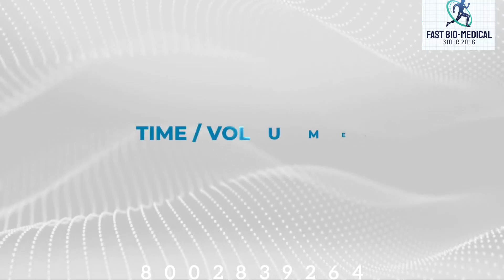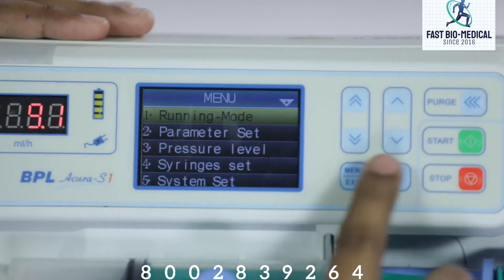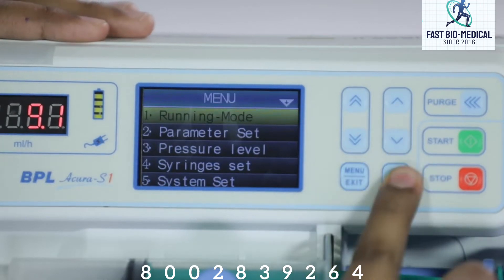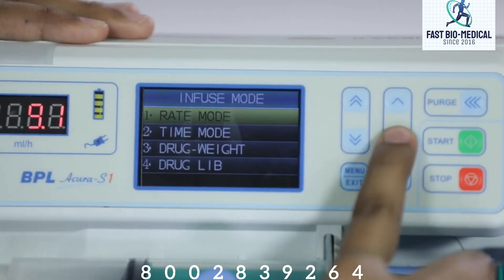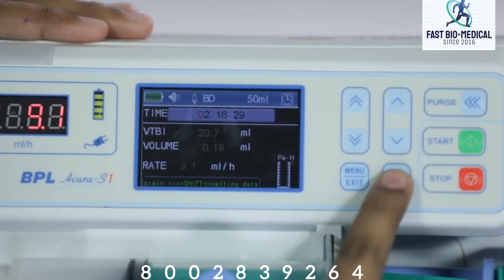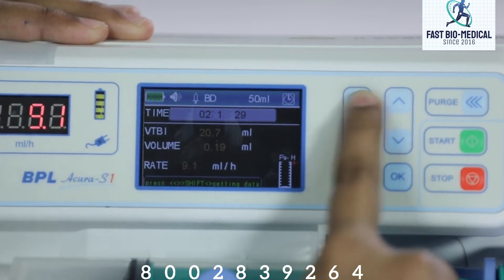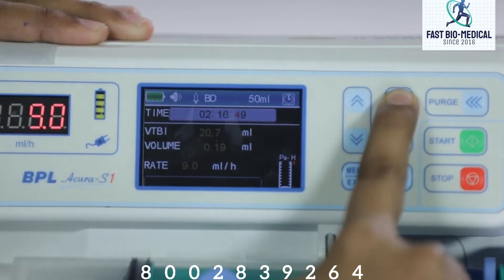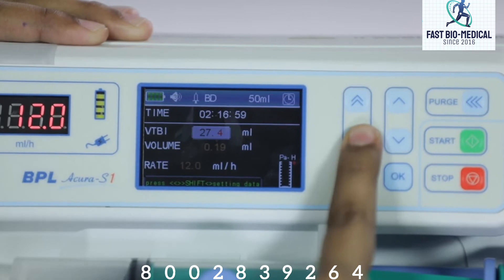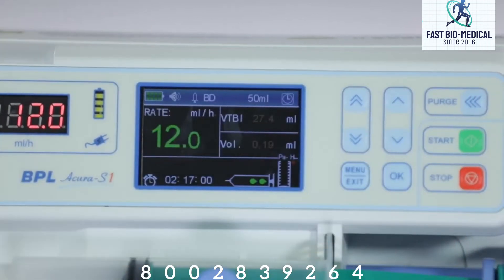Time or volume mode: press menu and the system will enter the main menu. Navigate to running mode and press OK to enter into running mode selection. Select time mode and confirm. The screen will show the time mode interface. Use the keys to set the desired infusion time, then input the volume to be infused. After these parameters are confirmed, press start to begin injection.